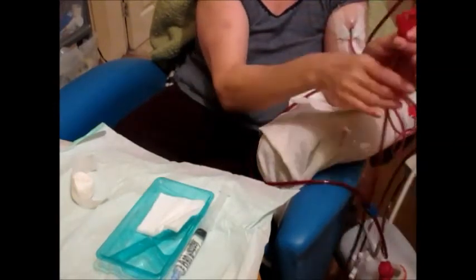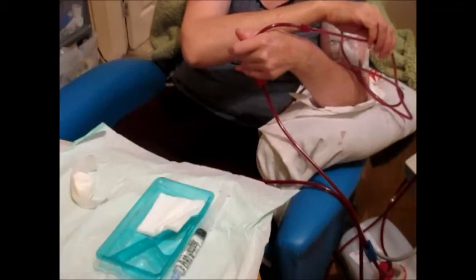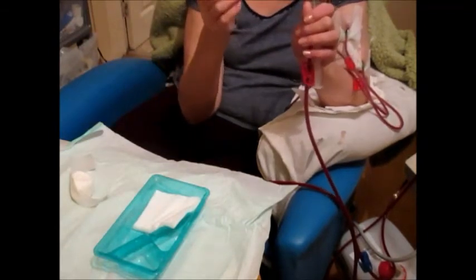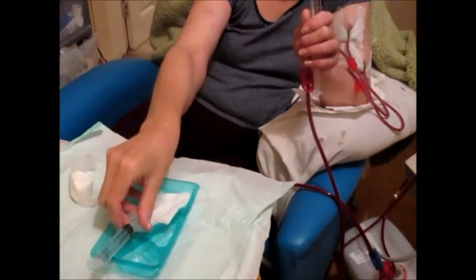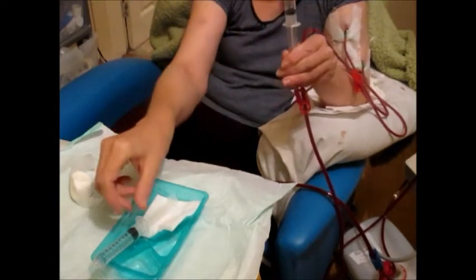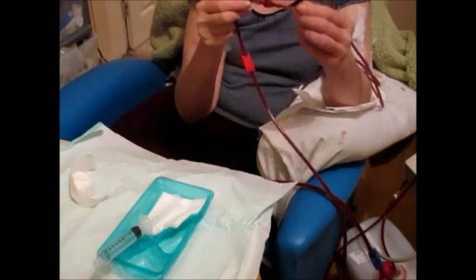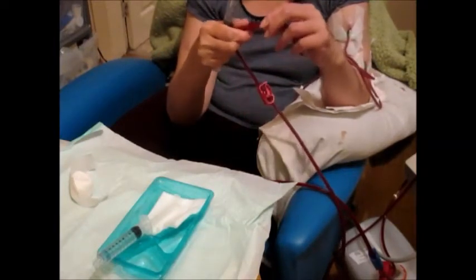I need to make sure that I clamp the arterial line. The syringe that I'm not using — you need to be careful; you don't just place it down on the field because it's not sterile now. So I tend to just pop it on the little tray so the connector and the end of it are facing away from anything.